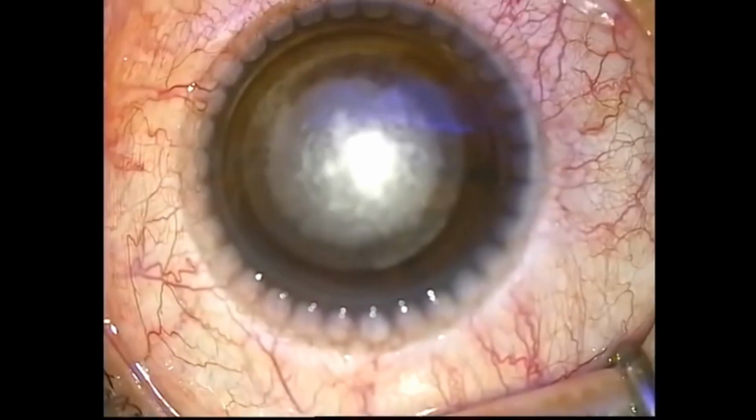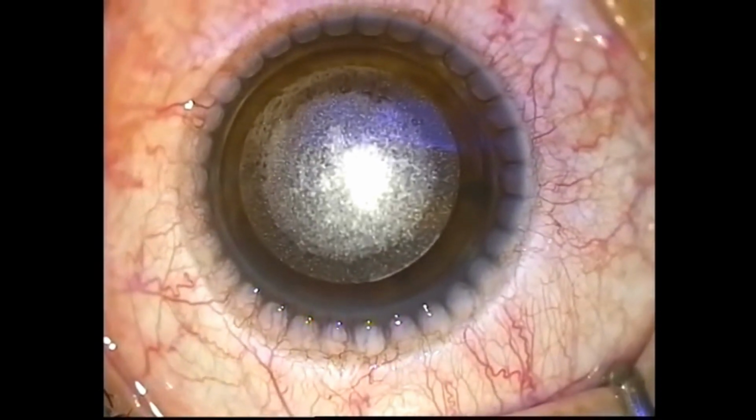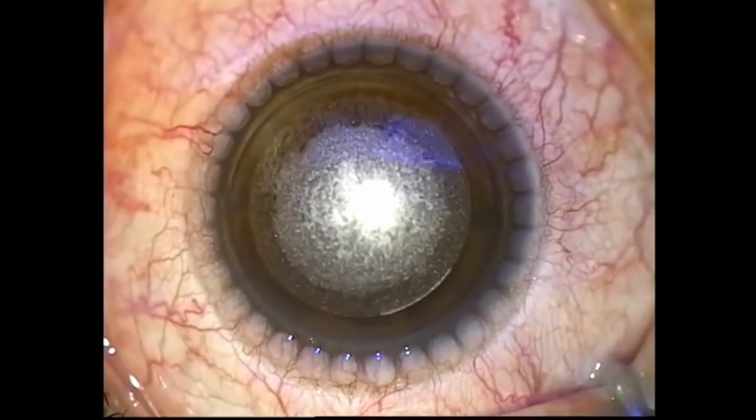And once you've made the cut, then you've got that arcuate cut from where you can remove that lenticule. And here you can see the docking is removed, the lens is removed, and once that's removed, you can see the cornea with a microscope, and you can see the area of the conjunctiva where the docking took place. You can see slight congestion and some marks over there. So that tells you that suction was adequate.